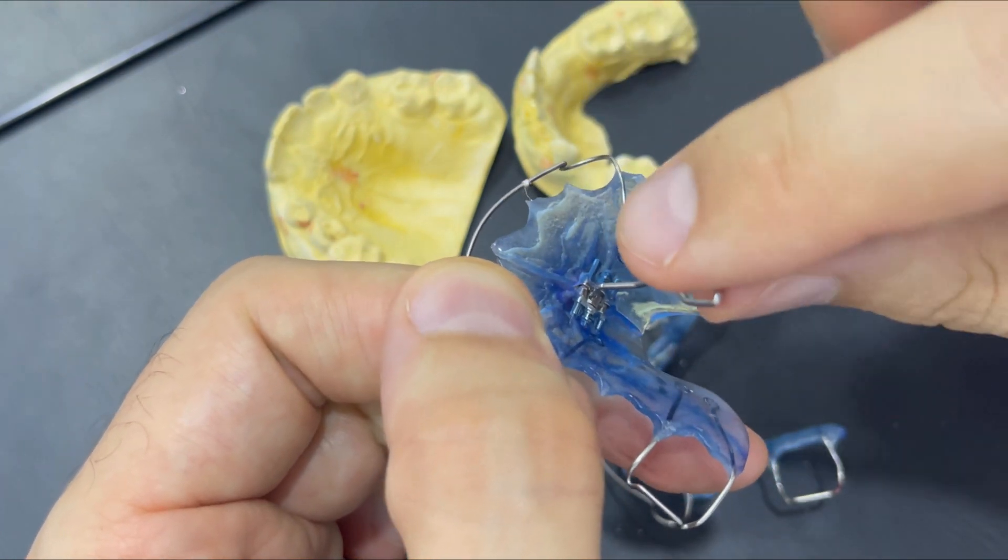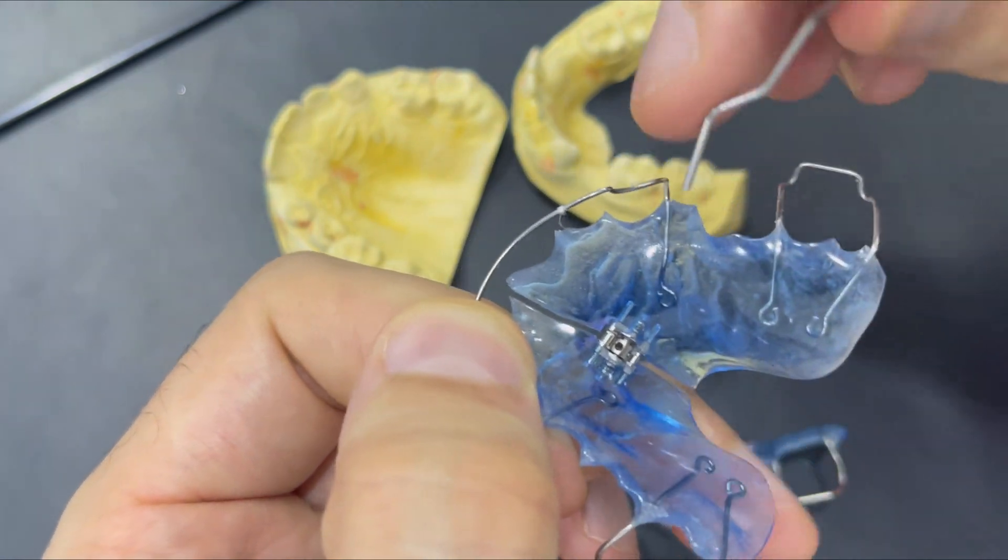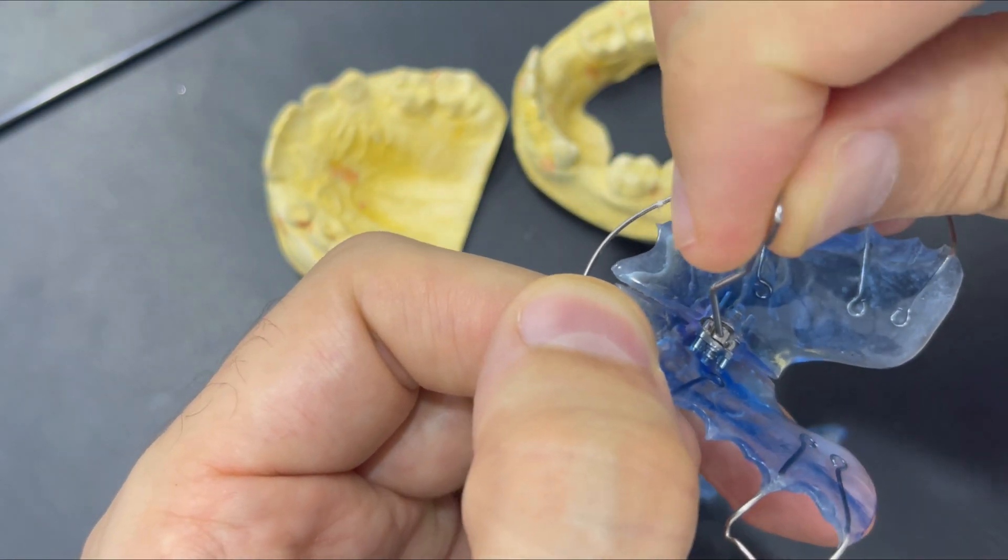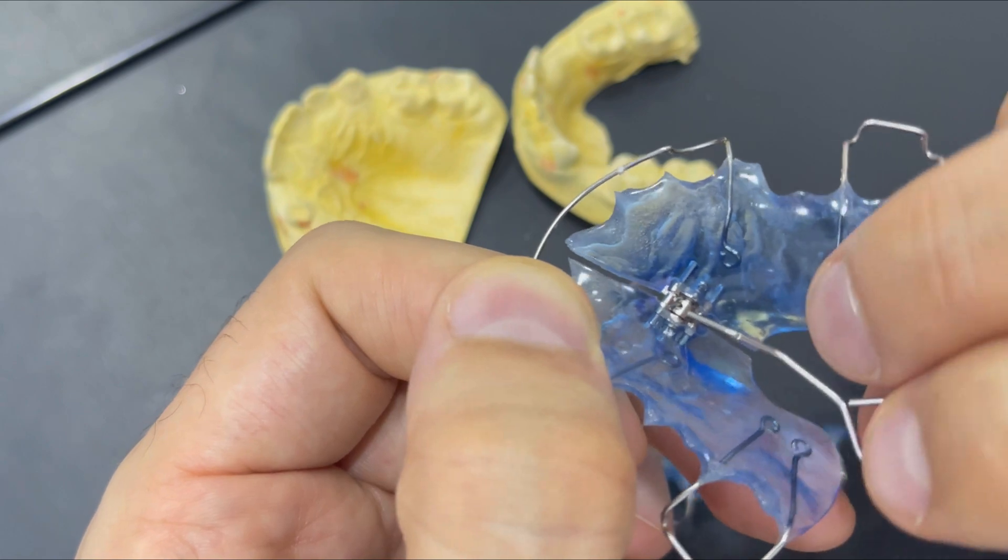Once we insert, we make sure that it's inside. We make the full turn and we see the other hole which is ready for the other turn.